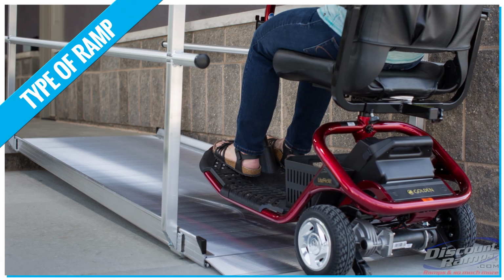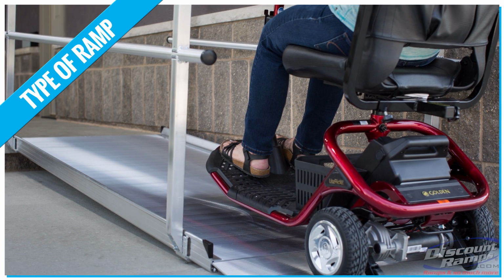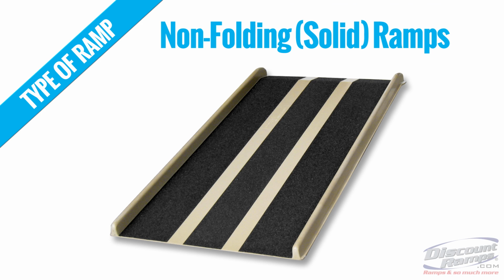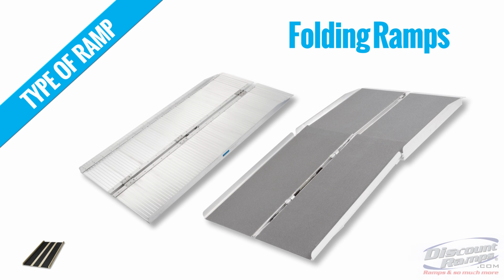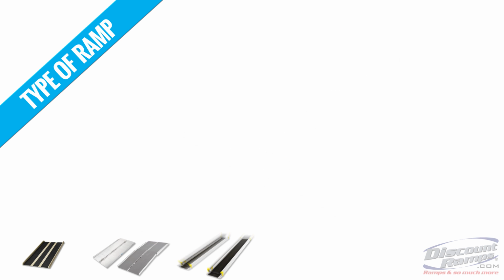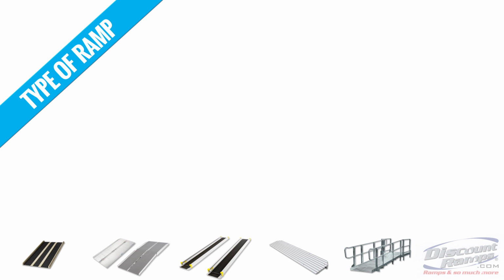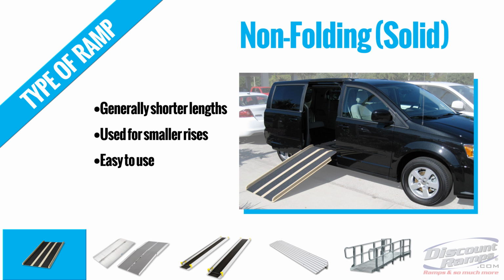The next important question is, what type of ramp do I need? Mobility ramps are very diverse, allowing you to find a ramp for your specific needs. They come in 5 basic types: non-folding or solid ramps, folding ramps, track ramps, threshold ramps, and modular ramp systems. Non-folding ramps are generally shorter in length and are used for smaller rises. They do not fold but are the easiest to use.